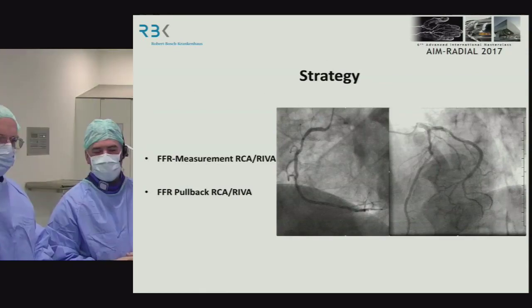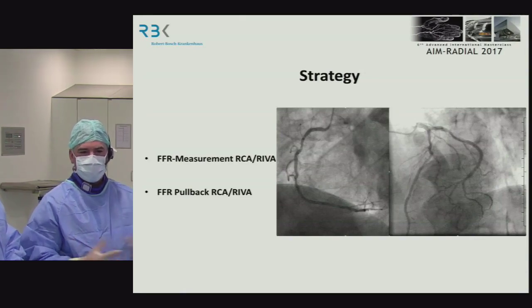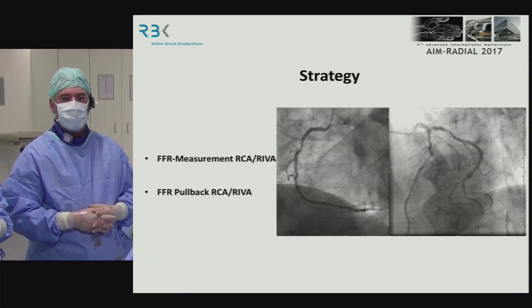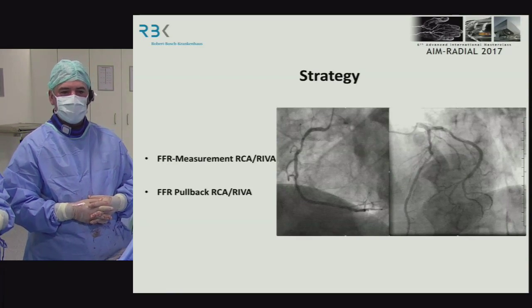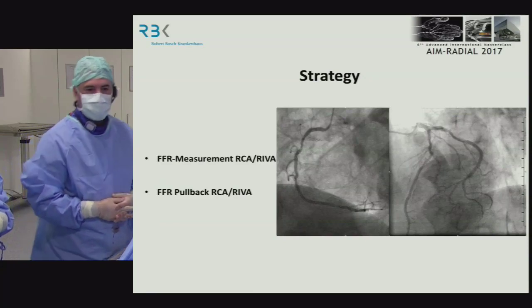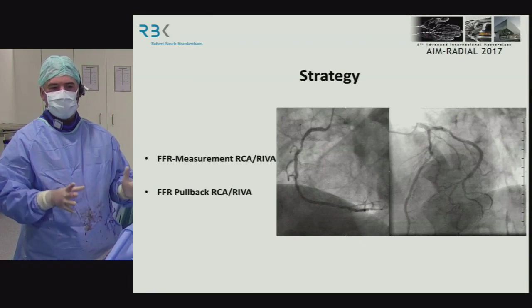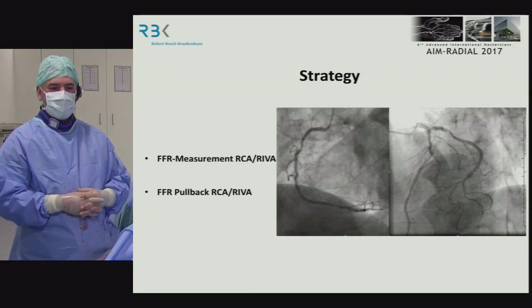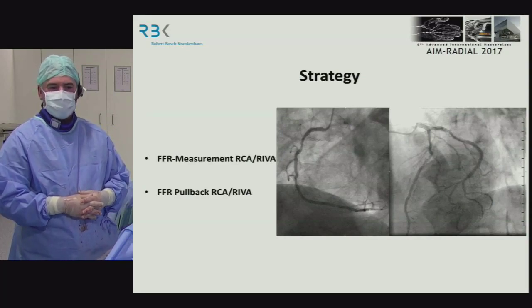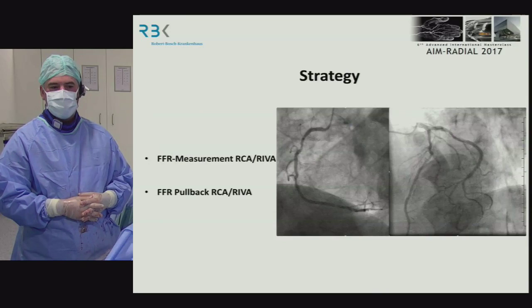Yeah, so a typical case, I guess, where you have a guy with troponin elevation. I think this is a matter of discussion where this comes from, probably from one of the diagonal branches, which are severely influenced by the coronary artery disease. I think today we will focus on the right coronary artery because this is the vessel which, by perfusion imaging, is putting the most burden of ischemia on the patient. It's a rather calcified vessel with diffuse coronary artery disease to the periphery.